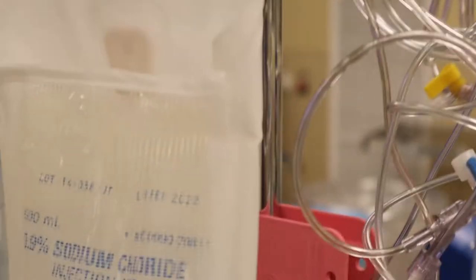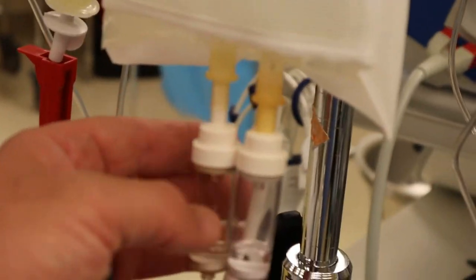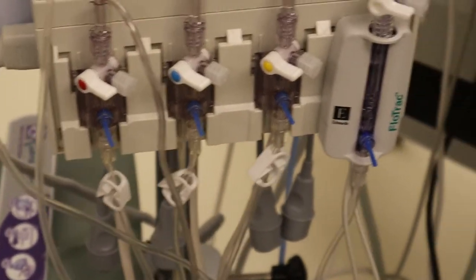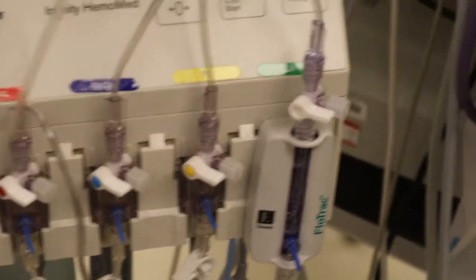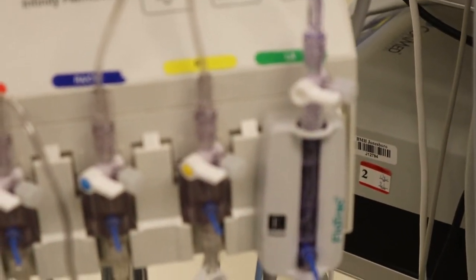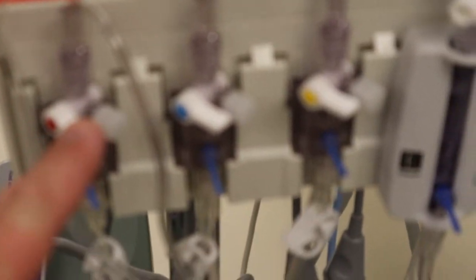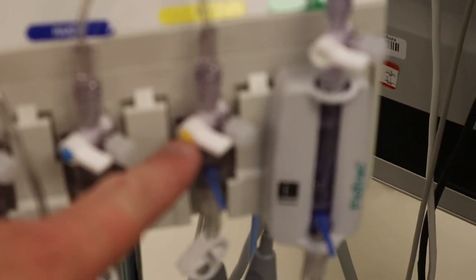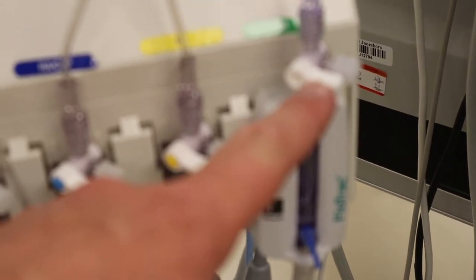Just to cover it again: we've got our 500cc bag, our pressure bag, our triple transducer that fills these first three spots on the hemopod, and then our flow track which goes into the far right — and that'll be for our femoral line. So from left to right, your transducers are your radial A-line, CVP, retrograde, and our femoral arterial line on the flow track.